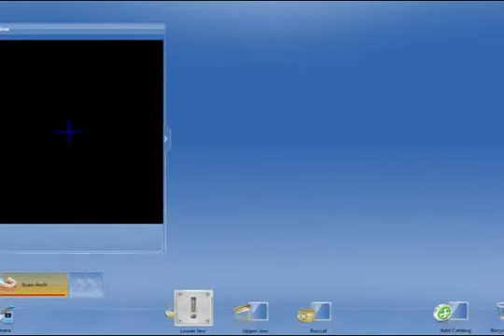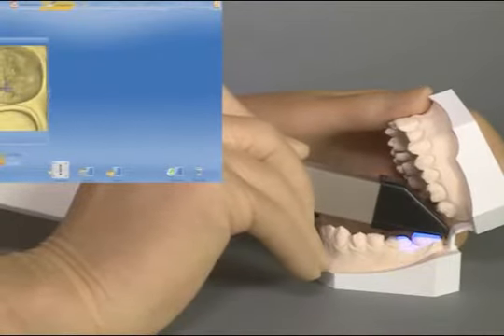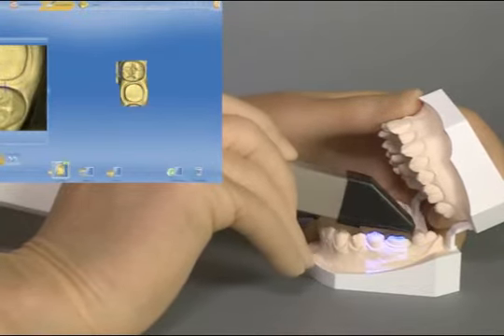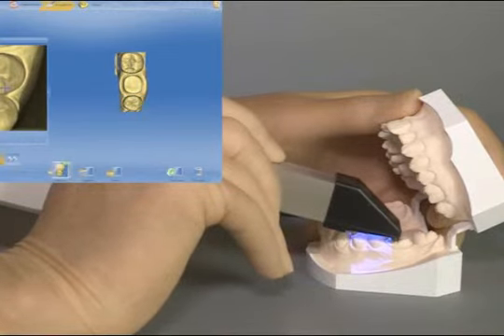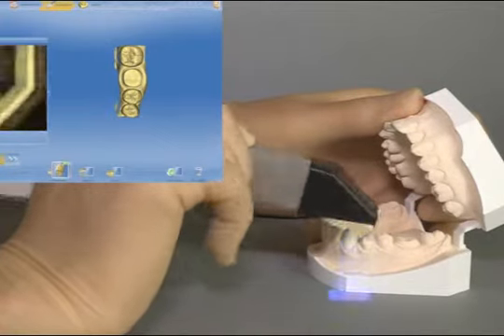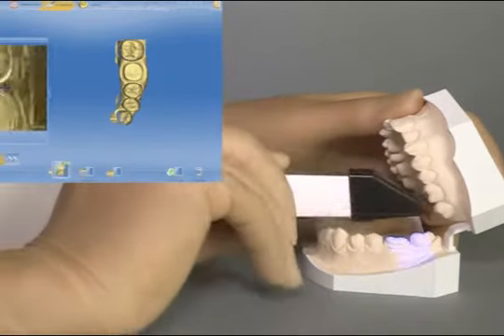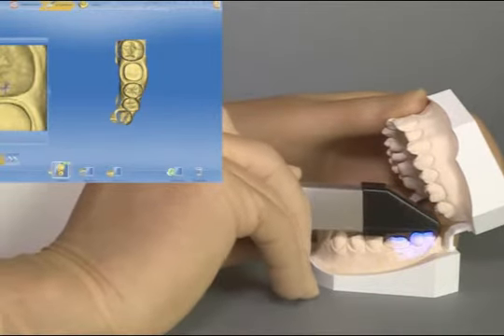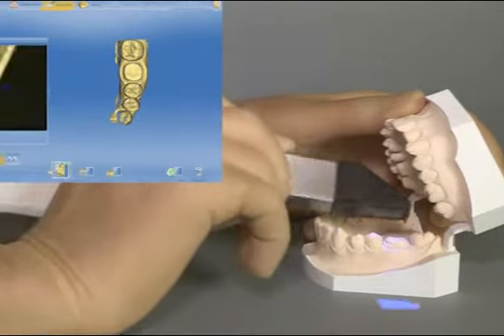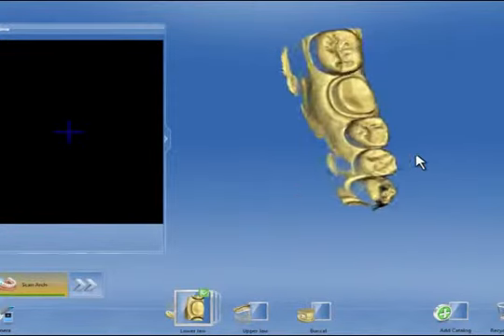We are now in acquisition mode for the lower jaw. We commence scanning from distal on tooth 3/7 with overlapping scans forward to mesial. In the premolar area, we tilt the camera slightly buccal-caudal to ensure we capture sufficient buccal facial surface for buccal bite registration. We scan the proximal contacts of the neighboring teeth so that any undercuts are also shown. This facilitates a better design of the interproximal area. We now check the model.